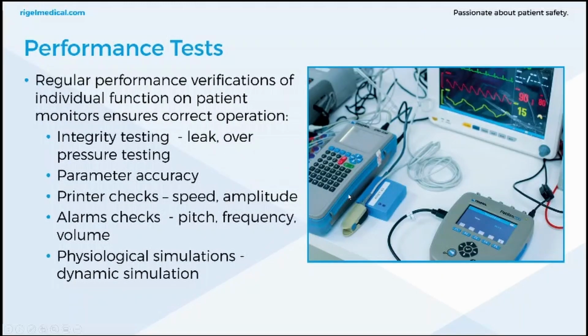So performance tests, also referred to as quality or functional tests, are typically executed using a patient simulator across a number of applications. And they're all part of an acceptance test, preventative maintenance cycle, or repair. Now, a typical test cycle for a vital signs monitor might include integrity testing, so leak and overpressure testing, parameter accuracy, printer checks with speed and amplitude, alarm checks, pitch, frequency and volume, physiological simulations, dynamic simulation.